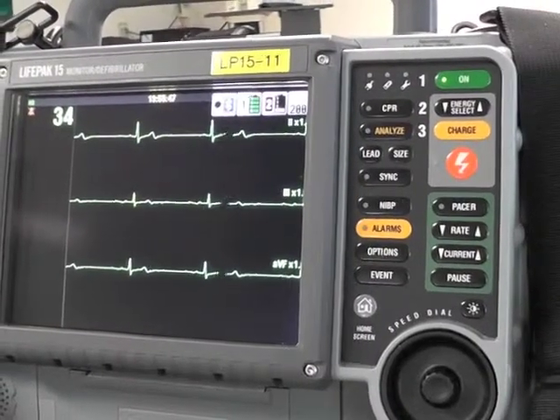It is organized. Do I have a pulse? Yes, you do. I do have a pulse. So at this point, I'm not going to resume CPR. I am going to have my EMT get a blood pressure for me and also run a 12-lead EKG for post-resuscitation. I am going to package this patient and get ready for transport to the hospital.